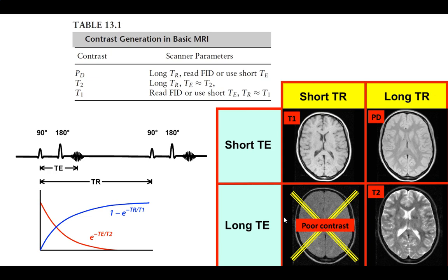That's what we'll watch decay, and we'll put the echoes in. So in essence, we excite it, the T2 stuff goes away, there's a little bit left, the T1 hasn't fully recharged, we kick it back down. Now it's all just T1 stuff, watch it decay and measure. That's basically what it is.